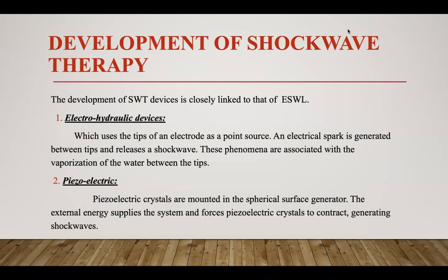Development of shockwave therapy. The development of shockwave therapy devices is closely linked to that of the extracorporeal shockwave lithotripter. First one is the electrohydraulic devices, which use the tips of an electrode as a point source. An electrical spark is generated between the tips and releases a shockwave.